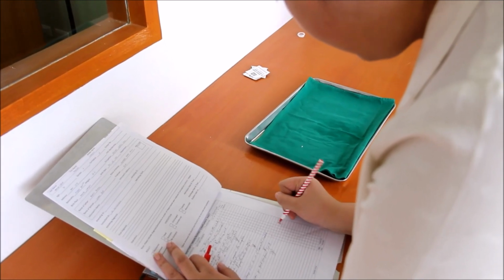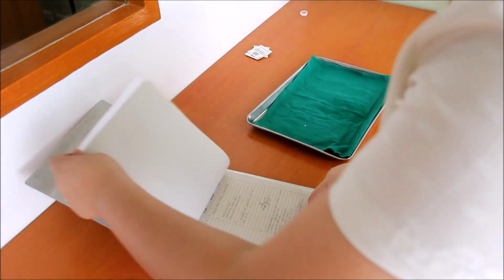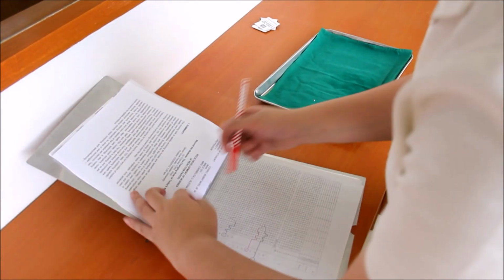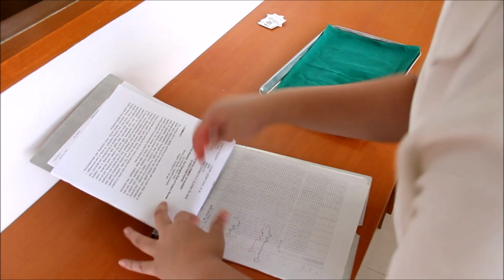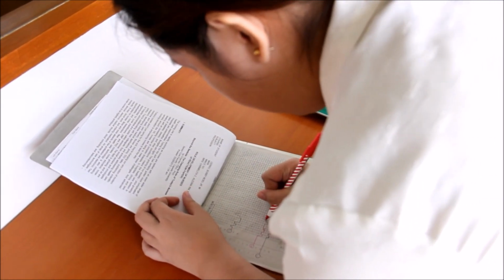Record starting the blood, including vital signs, type of blood, blood unit number, sequence number, site of the venipuncture, size of the needle, and drip rate.